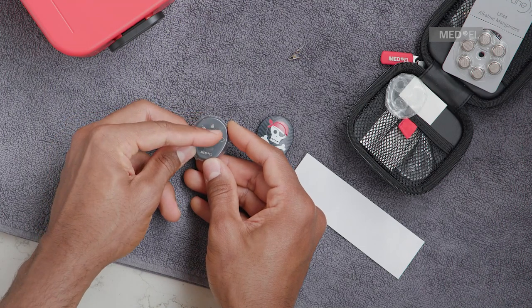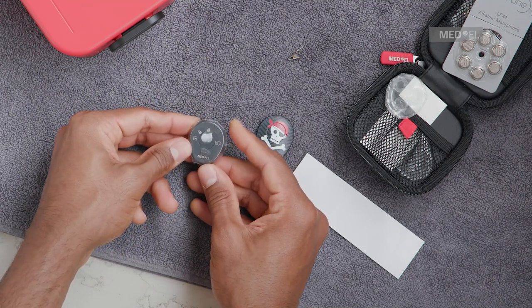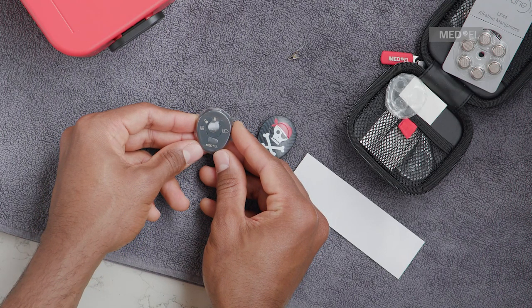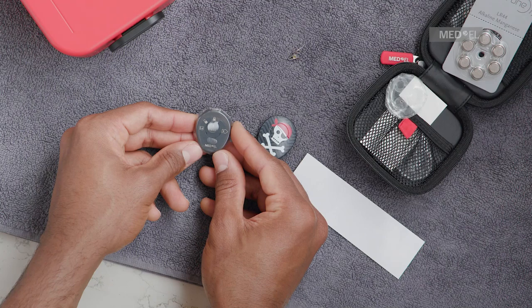For a watertight closure, it is essential that no wrinkles form on the flaps or edges of Waterwear. Avoid pulling on the additional fixation tab.